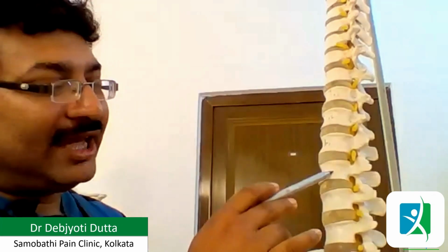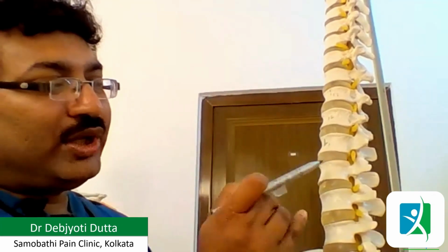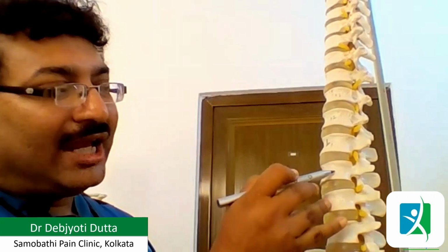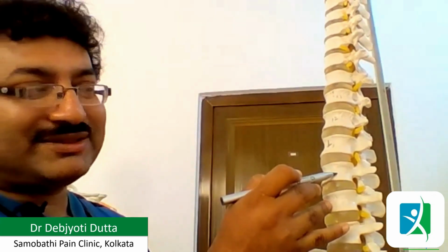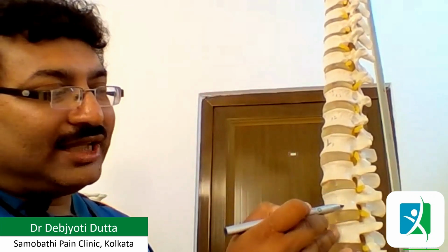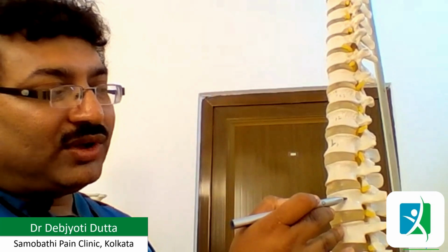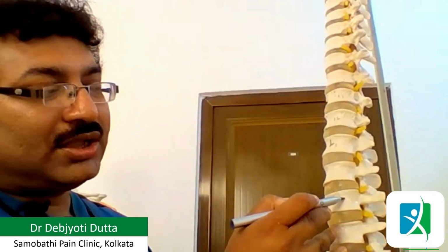That means the ganglion at the L2 level is situated at the junction of upper 2/3 and lower 1/3 of the height, at the anterolateral corner of the vertebral body, like this place. Similarly, the ganglion at the level of L3 is situated at the junction of the upper 1/3 and lower 2/3 of the vertebra, and it is also situated at the anterolateral corner.